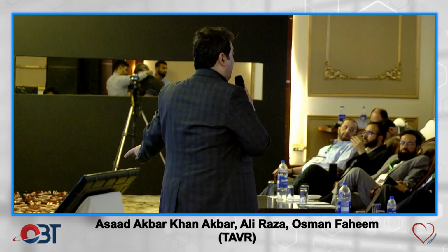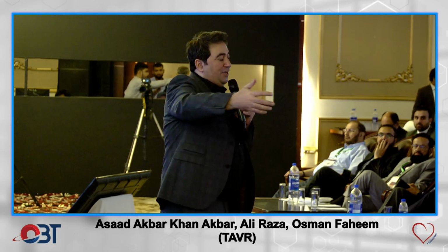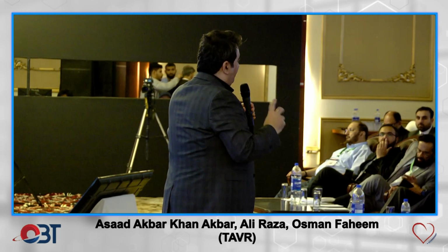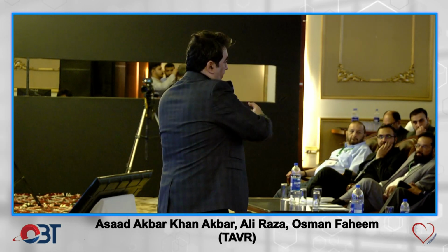What I do is that I do that sweep before releasing the valve. If I find the enfolding, I never go ahead and deploy that valve, because I've seen it, as others would remember, with the case we were doing in a workshop. And enfolding is bad business actually, is my feeling. So see it before, rather than afterwards, and make yourself unhappy.